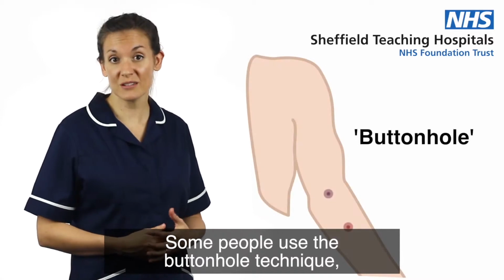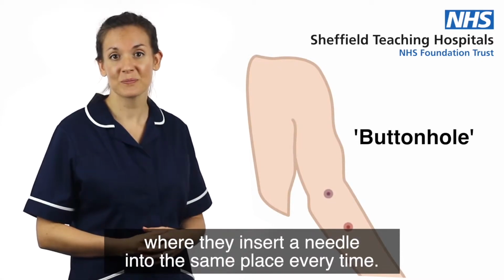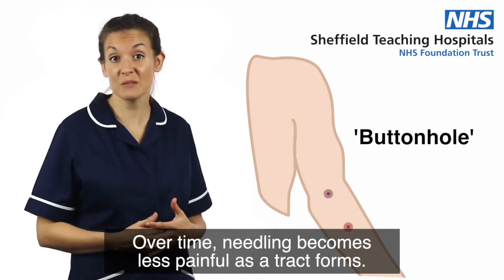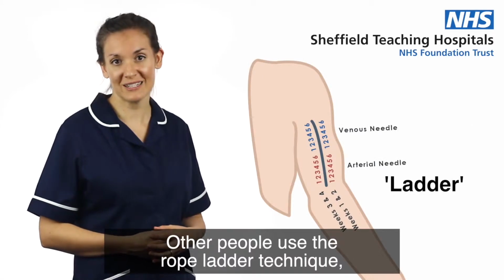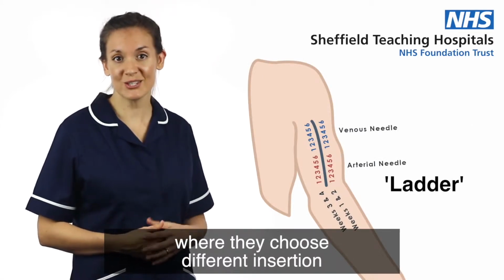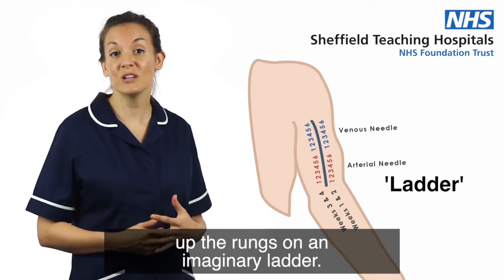Some people use the buttonhole technique, where they insert a needle into the same place every time. Over time, needling becomes less painful as a tract forms. Other people use the rope ladder technique, where they choose different insertion sites at each dialysis session, working their way up the rungs on an imaginary ladder.